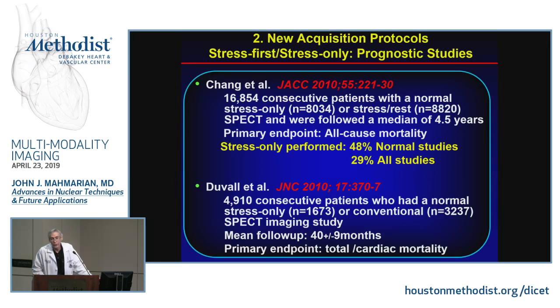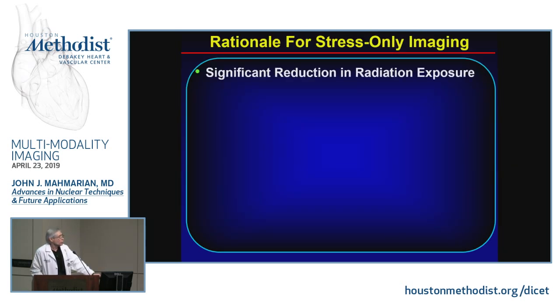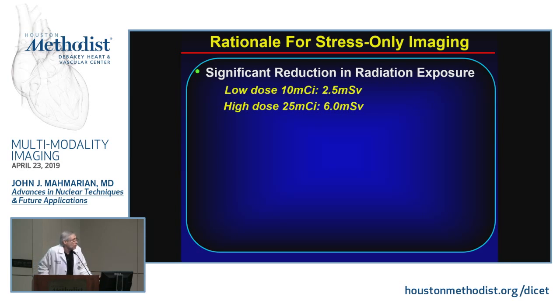So let's go into stress protocols. I've already talked a little bit about the issue of stress-only imaging, just from the previous study, EXERRT, and there are two major studies showing safety using this kind of protocol, and that if you have a normal stress study, you have the same outcome as if you do stress rest imaging. The reason for stress only is significant reduction in radiation exposure.